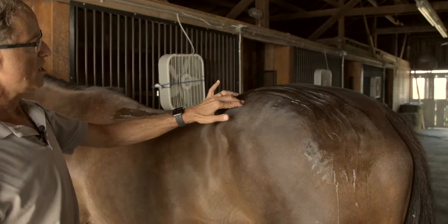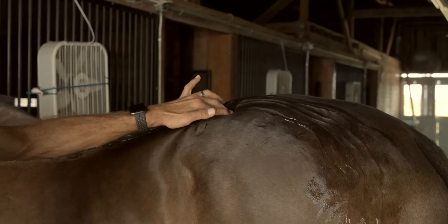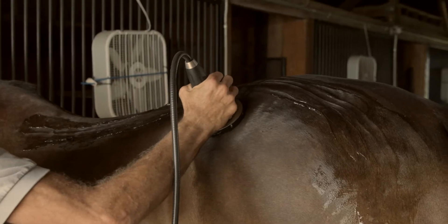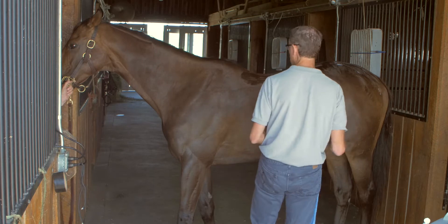Some horses, you'll get a lot of trigger points along here. This is another major acupuncture meridian, and it's really common for me to spend time going down in this area. And that's basically how I treat a traditional back.